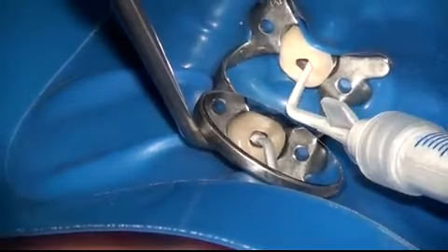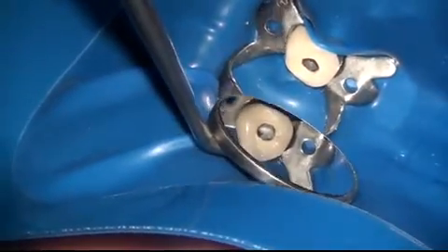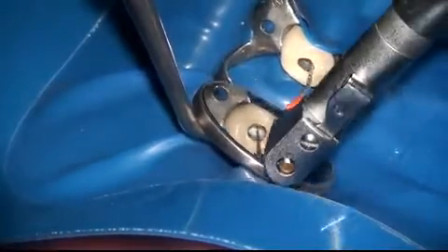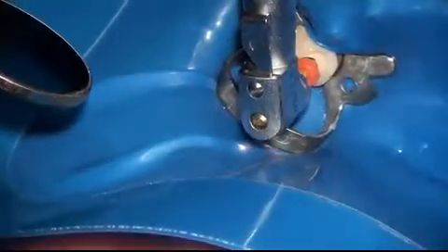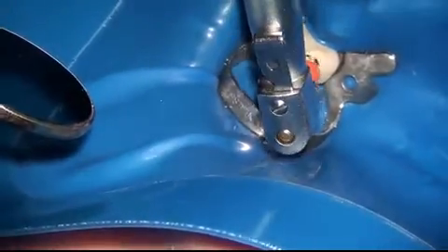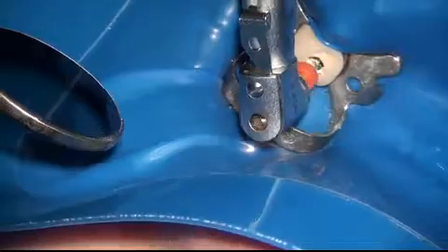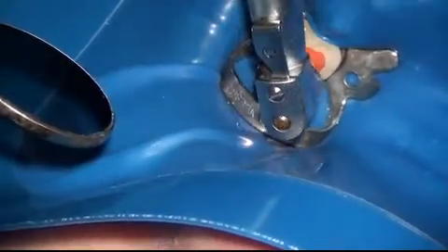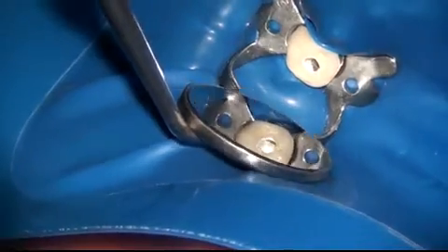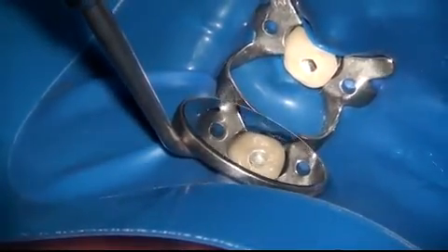I'm using the advanced obturation technique here, directly injecting the bioceramic sealer into the tooth. Once the sealer is injected, the MACPAC 25 tip is rotated at about 600 RPM, approximately one millimeter short of the apex in each canal. You only want to rotate at 600 RPM and not higher, because a higher RPM can be very dangerous in pushing material out.